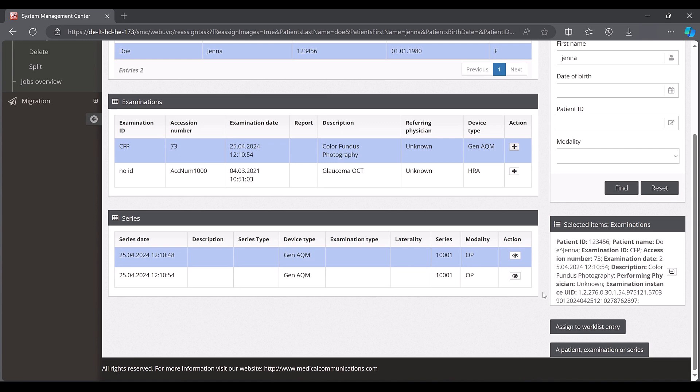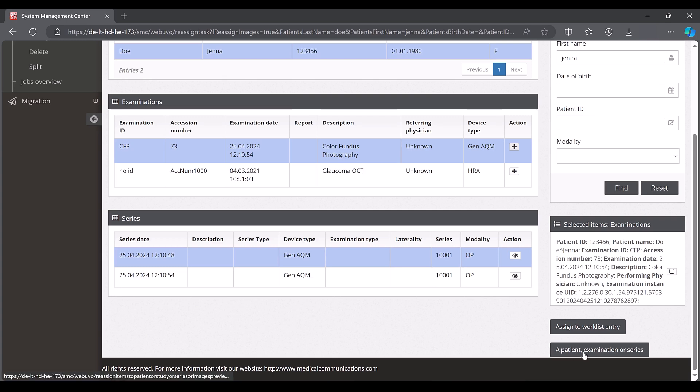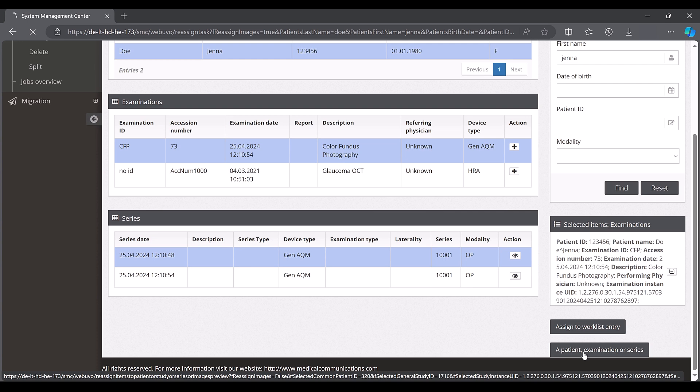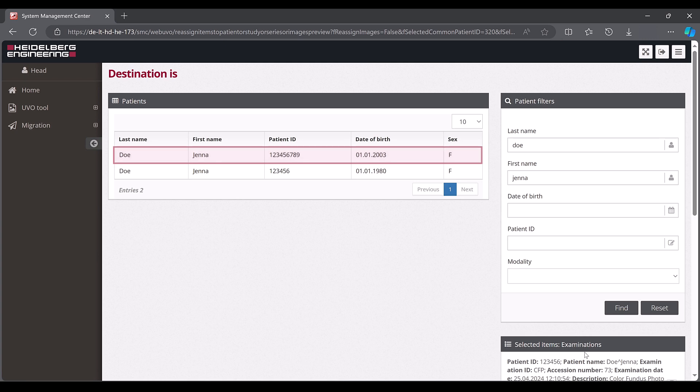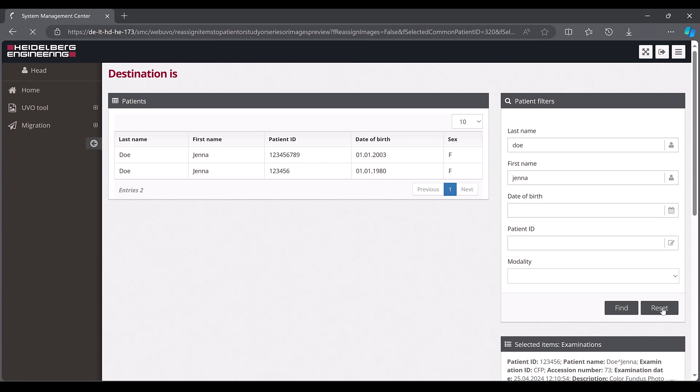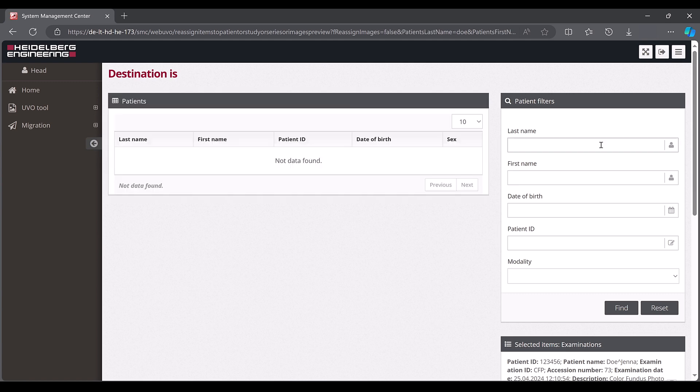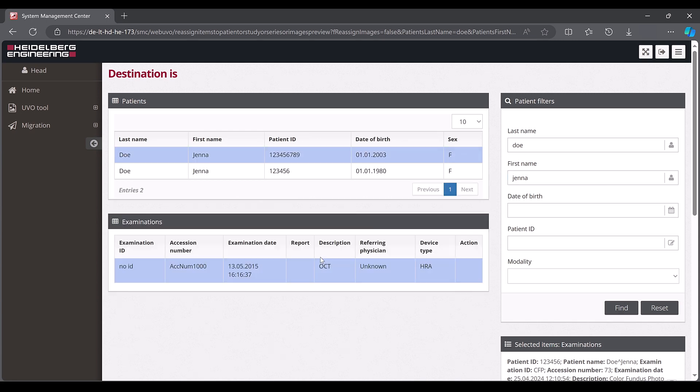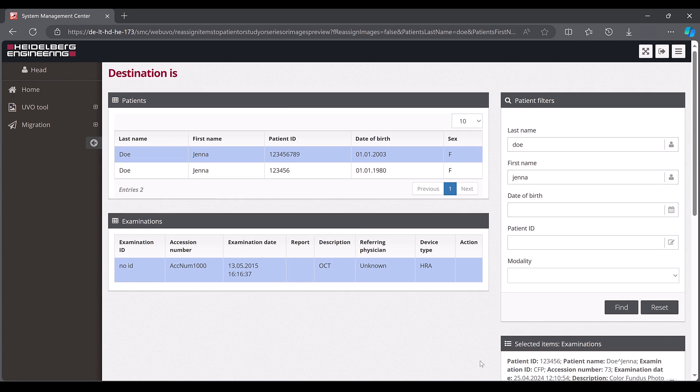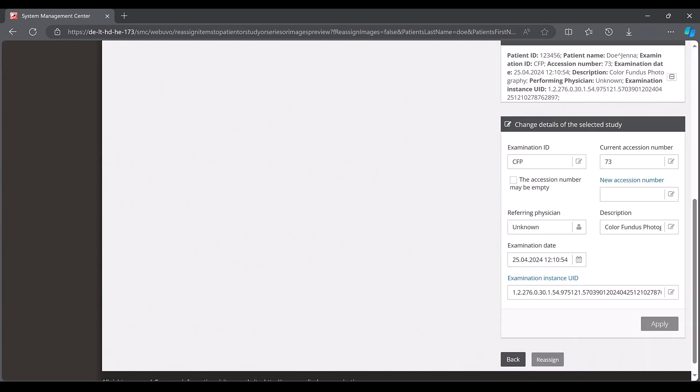These can either be complete examinations or individual images from an examination. All selected data is listed in the selected items area for a better overview. Once you have selected all the data to be moved, click a patient, examination or series to select the target patient. In our example, the patient Doe Jenner born in 2003 in the destination window. If the search parameters entered do not apply, click reset, enter the parameters of the target patient and click find.